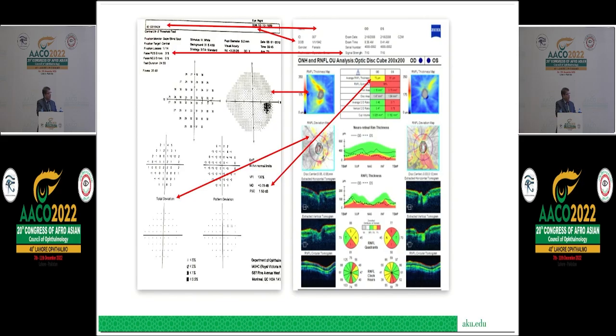So I just want to emphasize here that just like we look at a visual field and see, is it the right patient? Is it a reliable visual field? What does the grayscale tell us? What does the total deviation tell us? In the same way, an OCT scan can be looked at, and to make sure that it has the right information. Otherwise, we spend time interpreting, but it may be the wrong information. It may be the wrong patient. There may be an issue with regard to the signal strength, and we can talk about signal strength in a minute, and we can talk about quality in a minute as well.